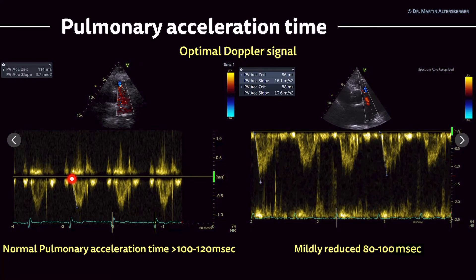If the Doppler signal is optimally aligned, you can also perform optimal measurements. Sometimes it's not that clear, so you have to perform several measurements or just save several beats to measure it multiple times. In this case, again, you see a normal pulmonary acceleration time.